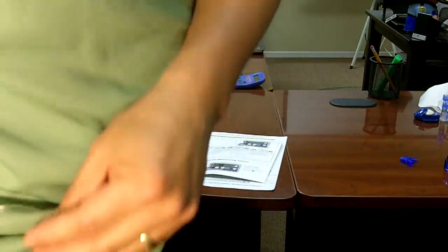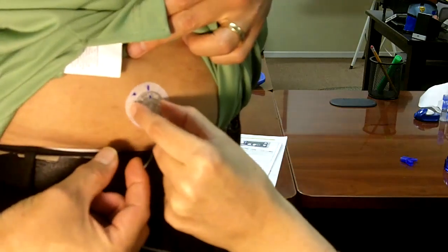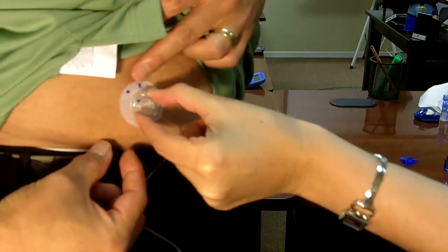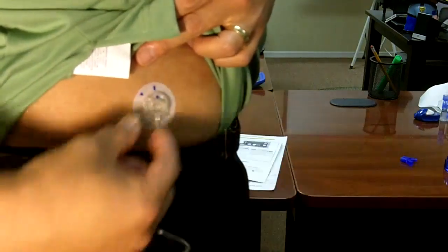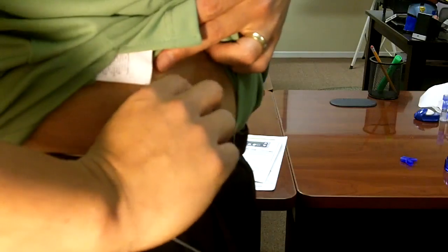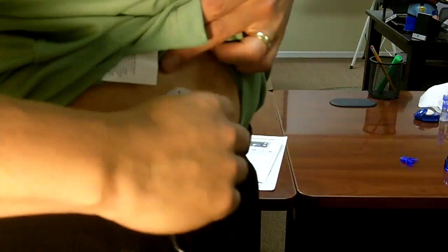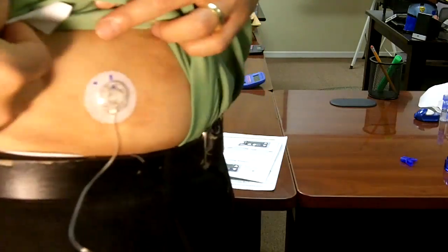The way you disconnect is you just pinch the sides right there and twist — you line that up, and then pull back. So you pinch the sides and twist. Easy.